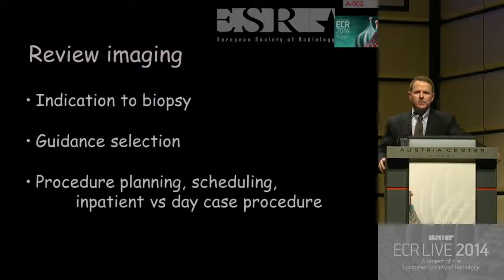Having said so, we are in our department and we are asked by one of our colleagues to do a biopsy on a patient with a tumor. The first thing that we do, we want to review the imaging. Because by reviewing the imaging, we see if there is indication to biopsy. We select the guidance that we want. We plan the procedure. We schedule it. We decide if we want to do as an inpatient or as a day case procedure, which is very, very important.